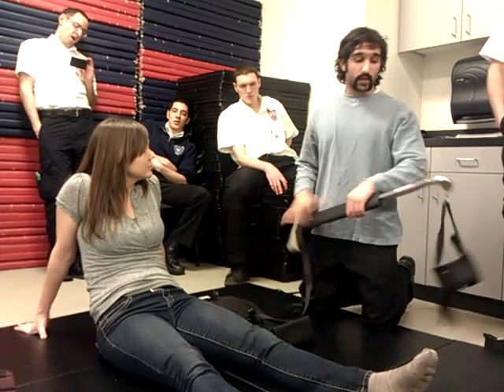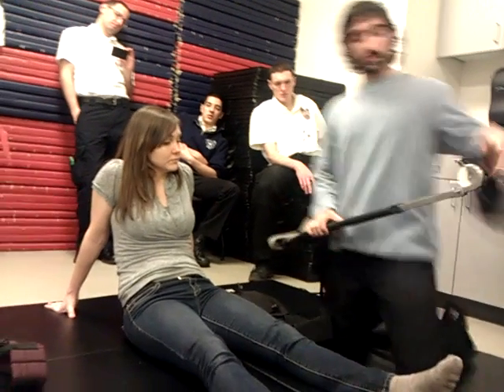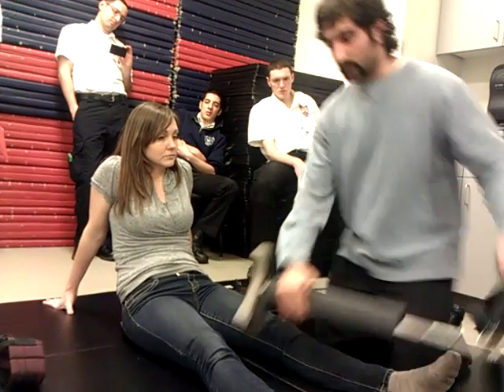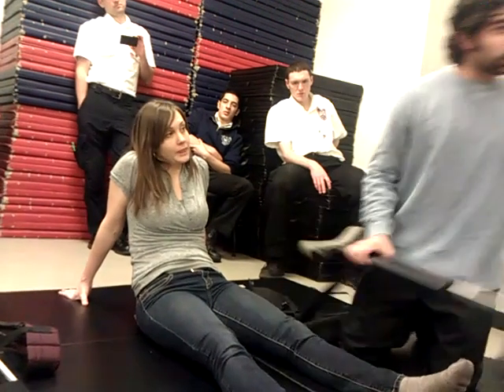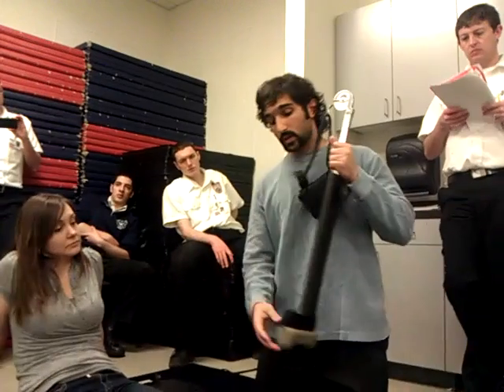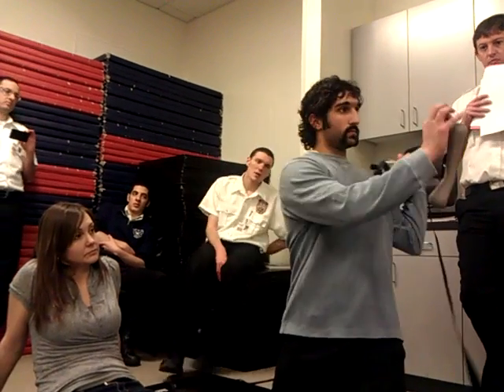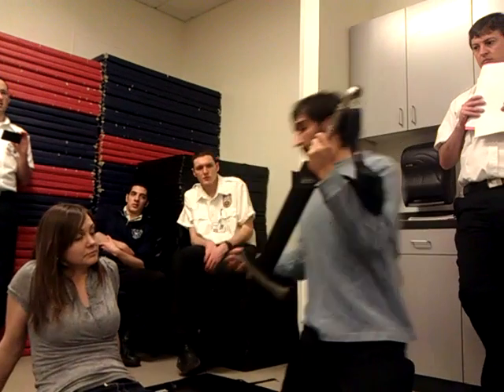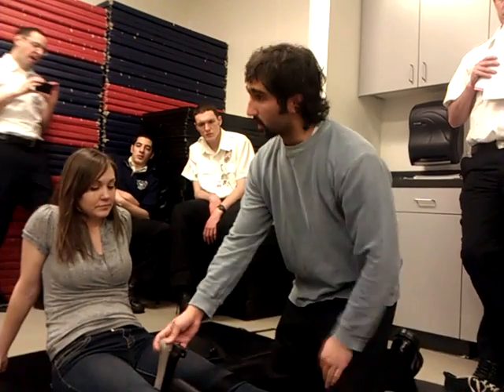So when you apply this device, it's kind of tricky in the sense that this needs to be facing outwards. You're not going to be placing the device with the dial facing inwards if it's a left leg injury, right? The gauge has to always be facing outwards, and the D-ring always has to be on top. So if it's a right leg injury, for instance, this wouldn't work and you'd have to make some adjustments.